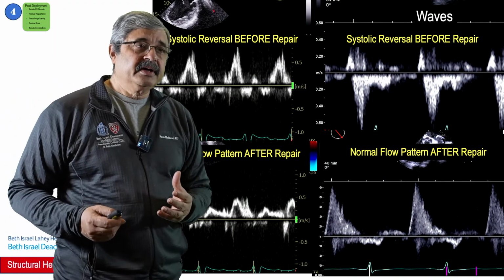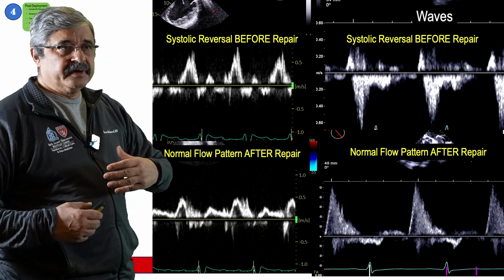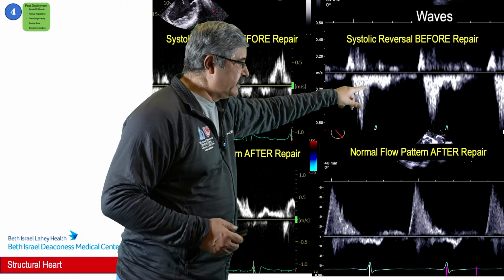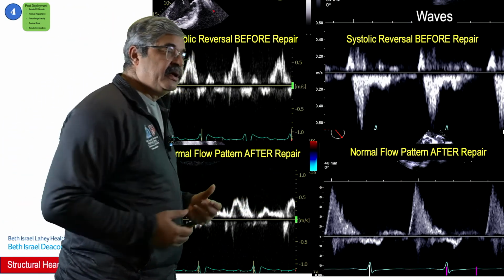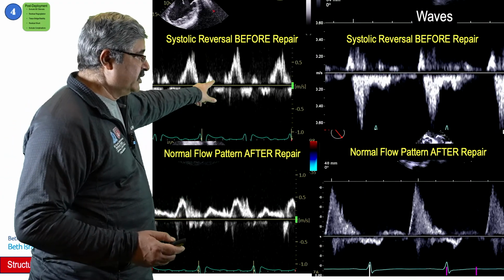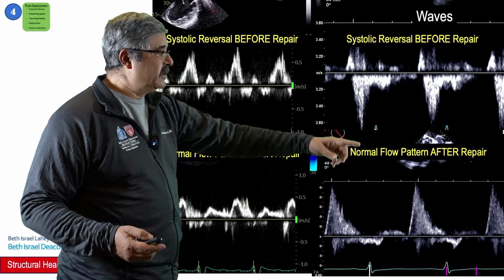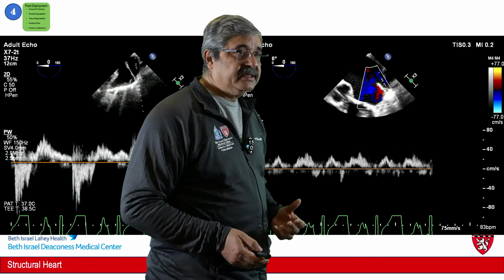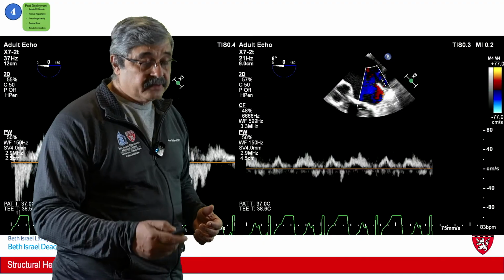One of the most gratifying parts is the demonstration of reduction in MR through reversal of waves. In severe mitral regurgitation, the regurgitation jet sometimes spills over into the pulmonary veins, leading to reversal of flow during systole. Every time there's systole, these waves are supposed to be positive, and these waves are negative, which means all that mitral regurgitation coming into the left atrium is spilling in a retrograde fashion into the pulmonary veins. If it was severe MR, and you put a clip in a good location with good results, this reversal is reversed and becomes normal-looking flow. For example, in this one, you can see significant reversal, which turned out to be positive flow. This is one of the most gratifying results. In this patient, you can see there was a massive reversal in the left upper pulmonary vein, which after reduction demonstrates no such reversal.